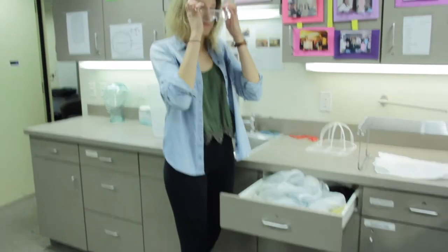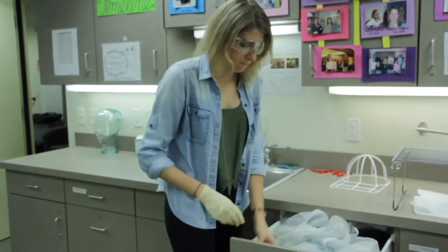Put on goggles and gloves located in the drawer to the right of the sink. If you want to protect your clothes, use the raincoat.